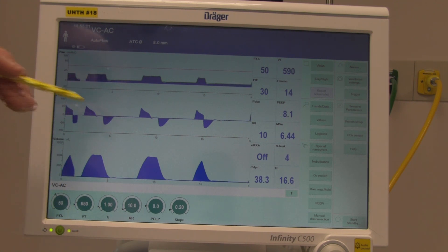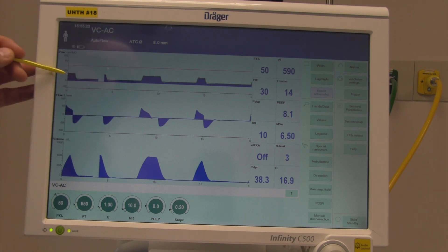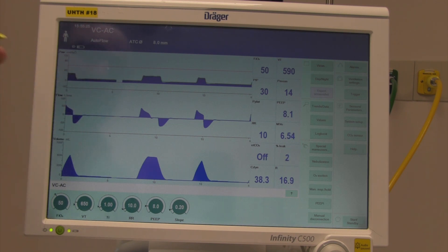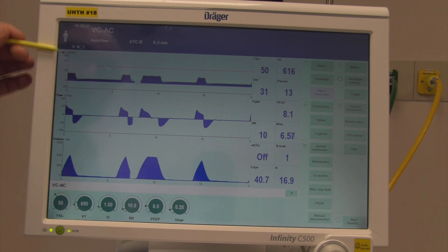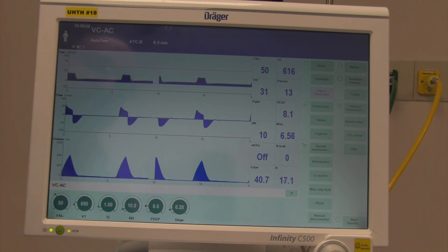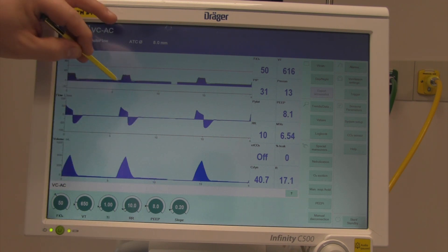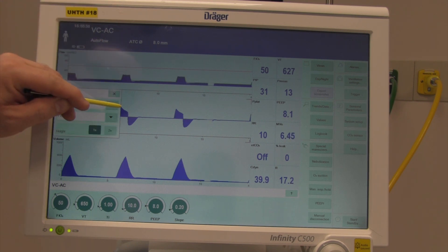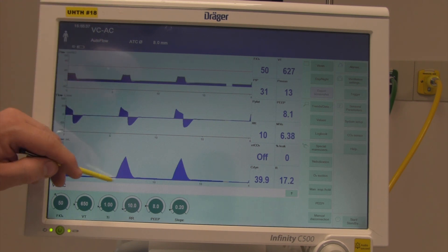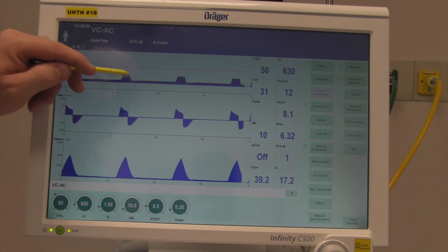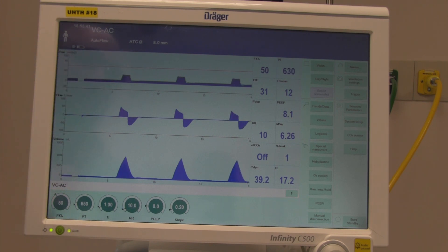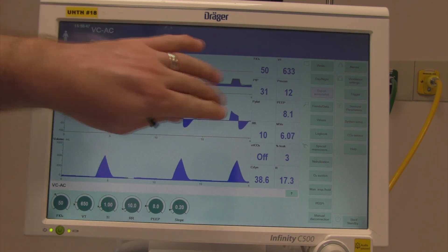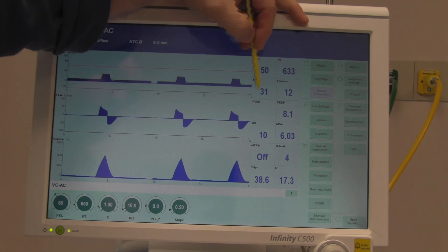Now let's look specifically at the pressure waveform — this is a scalar pressure-versus-time waveform, one of the easiest to read. The breath starts here, this is our inspiratory flow in, then our volume going in, and at the maximum is where the pressure lets off. When looking at static compliance, we're actually looking at the plateau pressure.